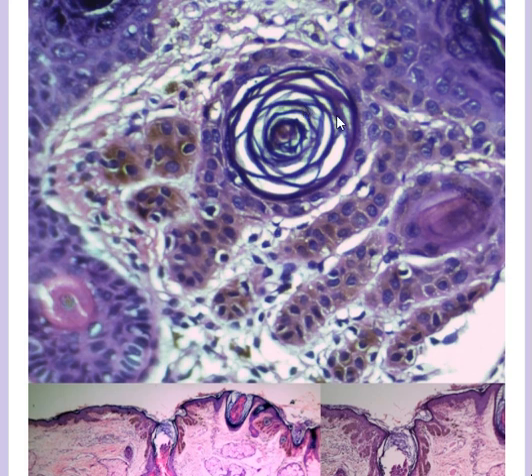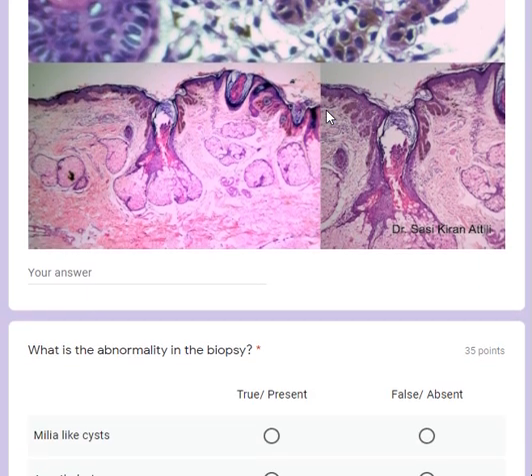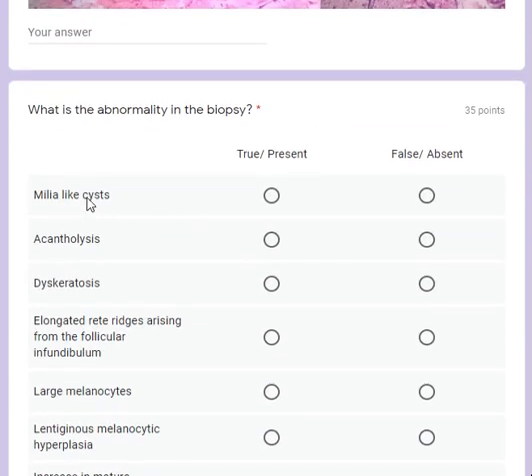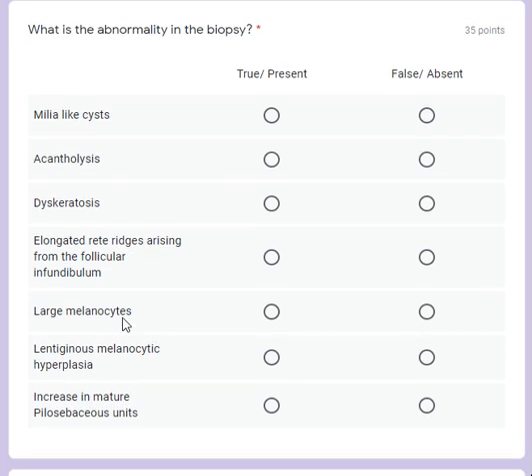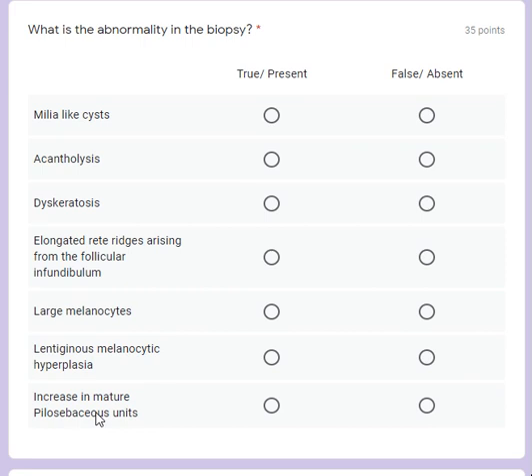Because of these cystic structures associated with this condition, you often see acne and hidradenitis suppurativa more commonly associated with Dowling-Degos disease. Milia-like cysts are present; there is no acantholysis or dyskeratosis. There are definitely elongated rete ridges. The melanocytes are normal in size - not large - and there is no melanocytic hyperplasia.